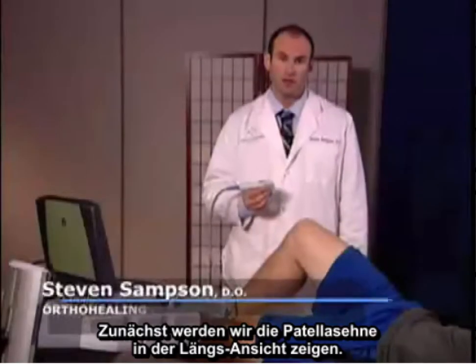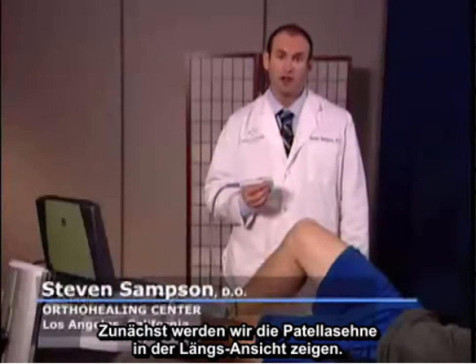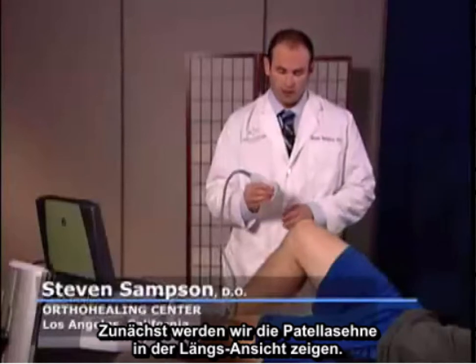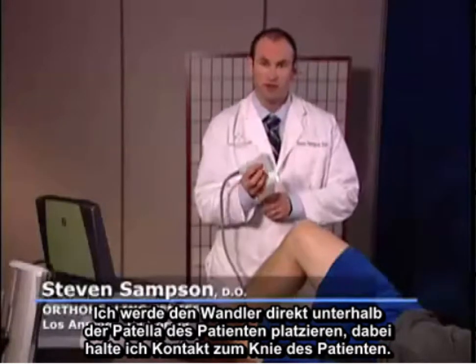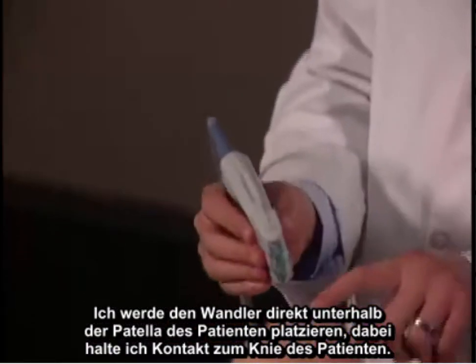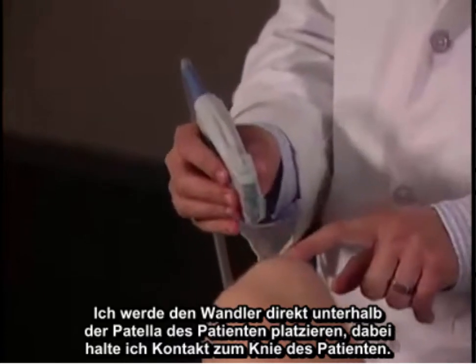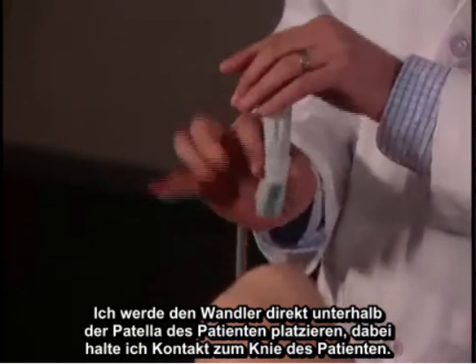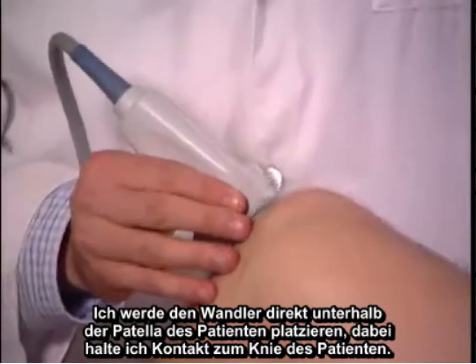Next, we're going to view the patella tendon in its longitudinal view. I'm going to place the transducer just beneath the patient's patella, maintaining contact on the patient's knee.